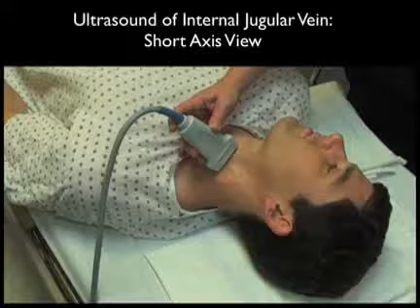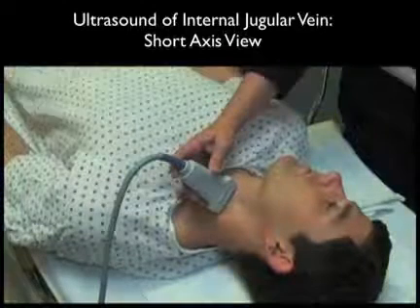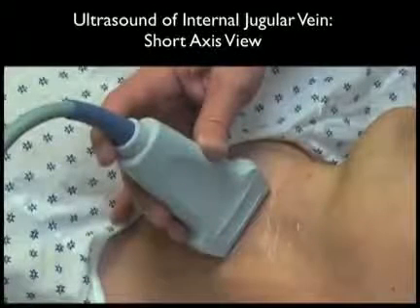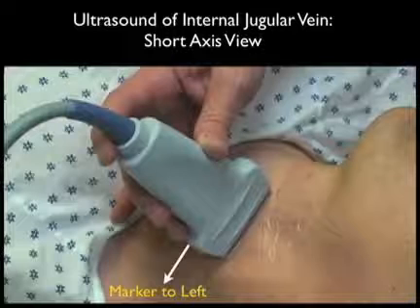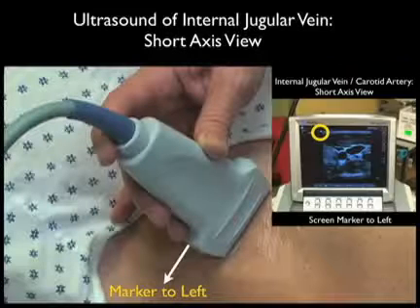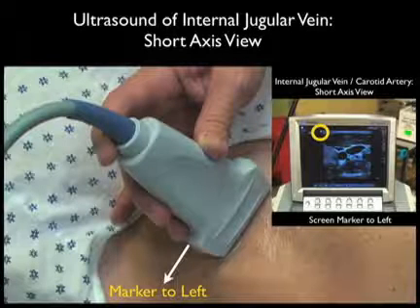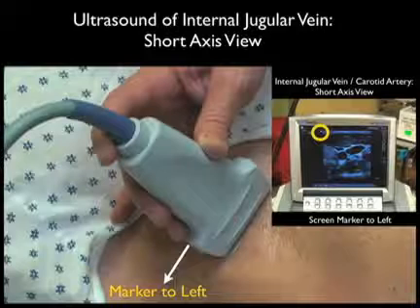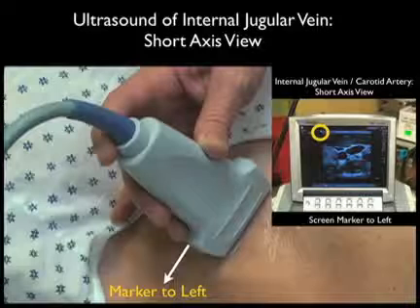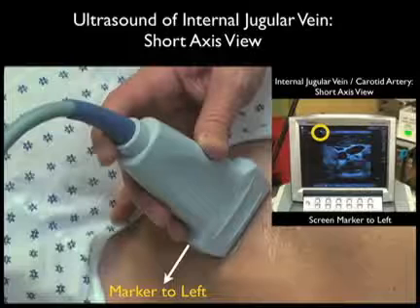Here's the high-frequency linear type array probe placed over the middle triangle of the neck, over the internal jugular vein and carotid artery. Now, I like to have the probe positioned in a side-to-side orientation with a marker dot oriented towards my left as I stand at the head of the bed. The reason for that is then the orientation of the probe marker will line up to the orientation of the screen indicator dot, which we see here is oriented towards the left on the ultrasound screen. Thus, the left side of the probe will orient directly to the left side of the screen, and this will allow us to orient ourselves as we place the needle underneath the patient's neck and cannulate the vein.